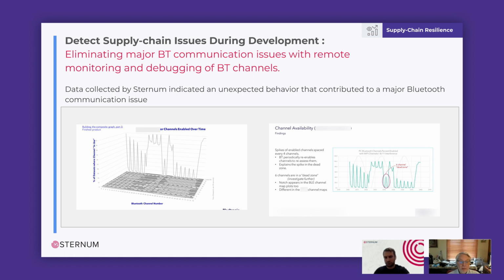Like, for example, if a Bluetooth developer doesn't know about the ability to read the channel maps from the implant, you won't get this data. So depending on what kind of interfaces you have and what kind of data you can get from it, you'll have to do some digging to figure out what are the most useful parameters for characterizing the performance. And that was an interesting exercise in all this too. A lot of this was originally just exploratory. Well, let's see what happens if we monitor this.